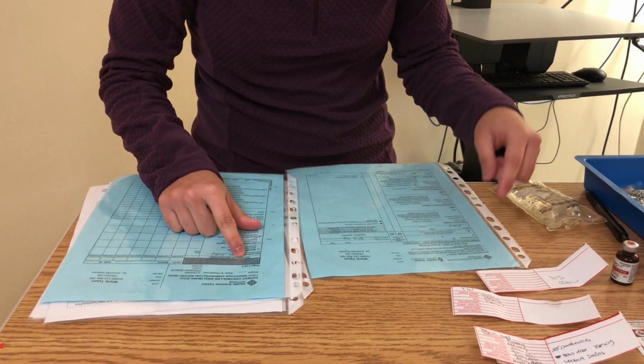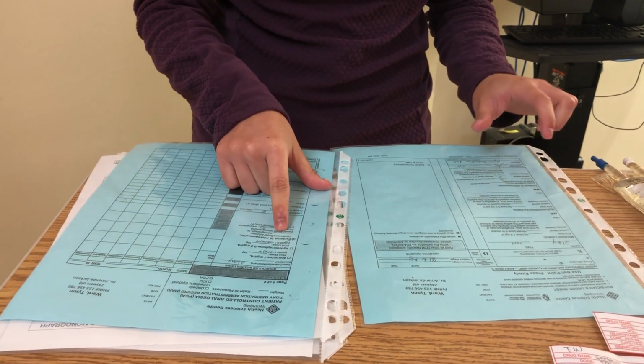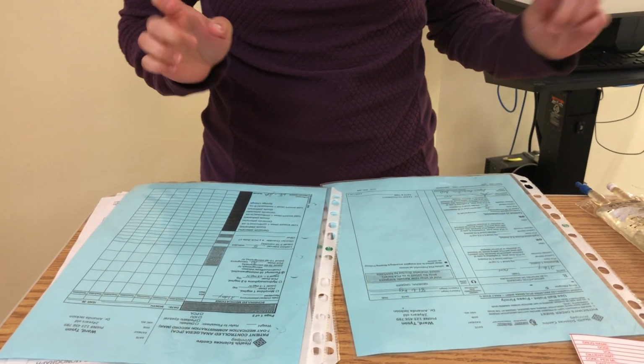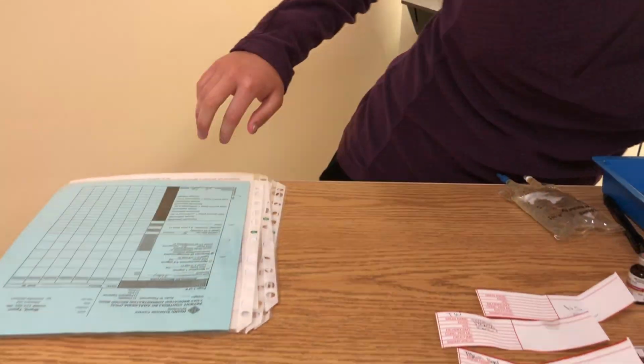No known allergies. So the doctor ordered fentanyl, 10 micrograms. This is 10 micrograms per ml, lockout interval of 5 minutes. So the physician's order and the MAR have been signed and transcribed properly, so that's good.